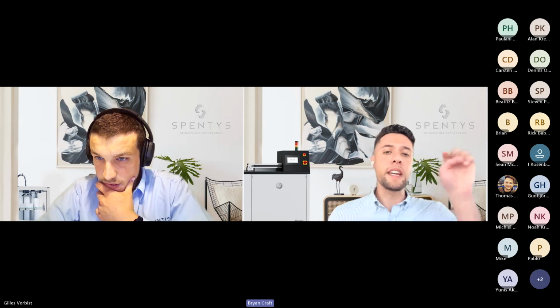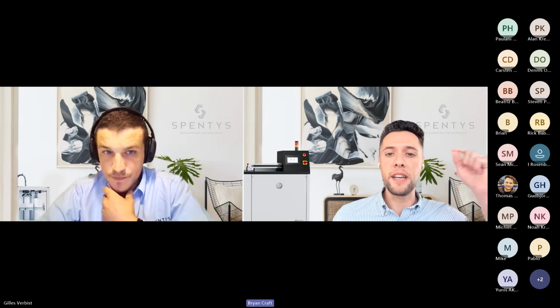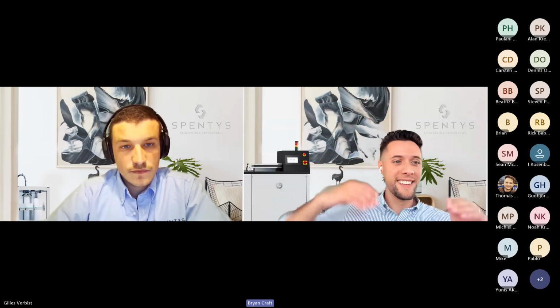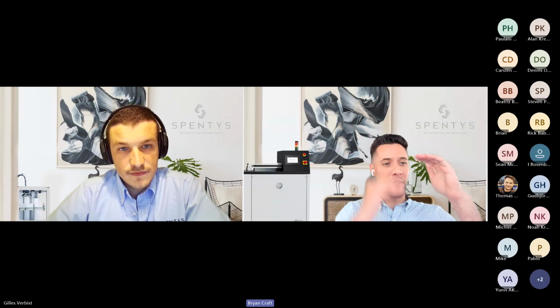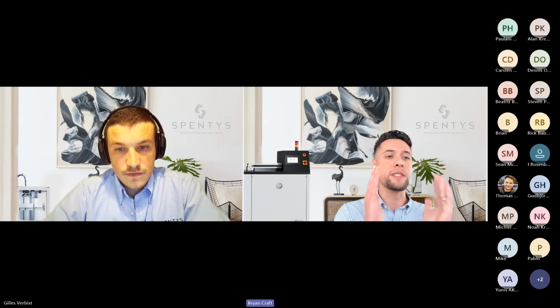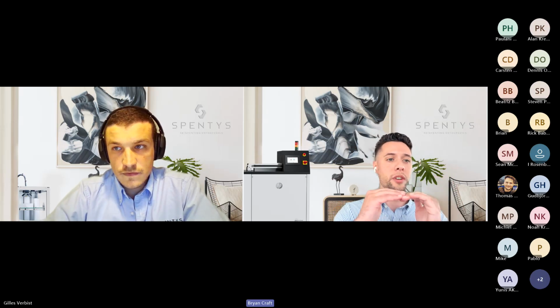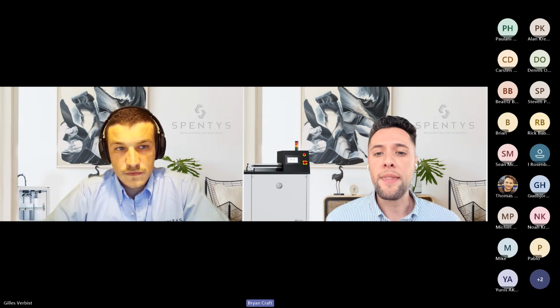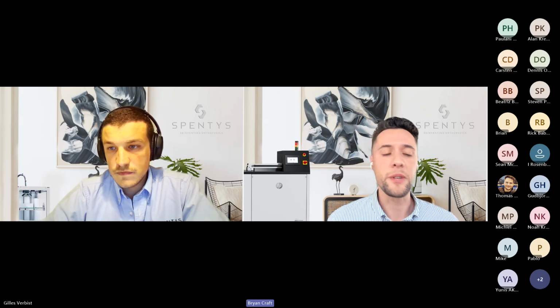Yeah, on scan height, when Sean asked about scan height and the ability to adjust it, you showed how to go lower. One thing that we could do, Sean, I'll send you a quick video of that specific step of the workflow to where you could be able to extend it if you so choose. And then measurement of the height, yes, we have that.